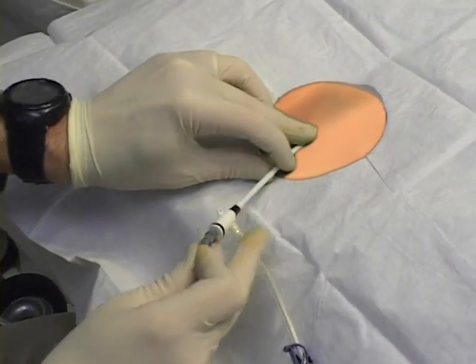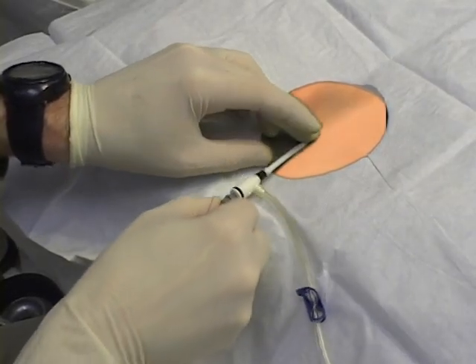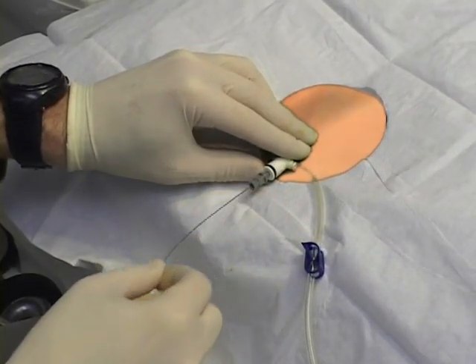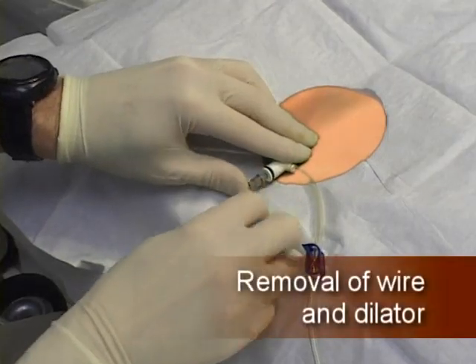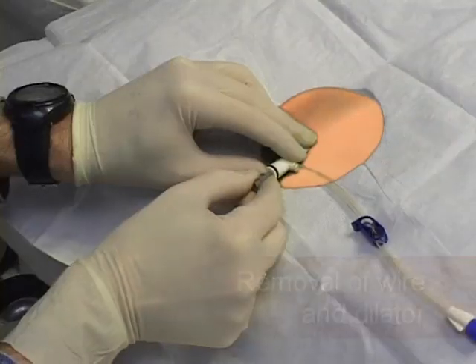Fully insert the catheter before withdrawing the wire. Then remove the dilator and test the catheter before securing it to the patient's skin with suture. Free-flowing blood through the catheter suggests proper catheter placement.